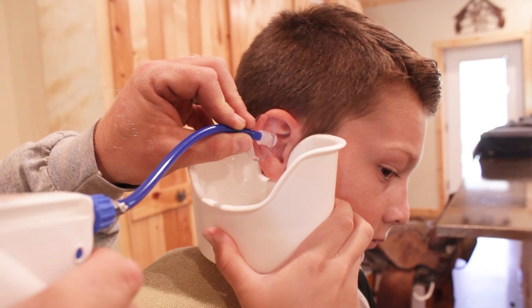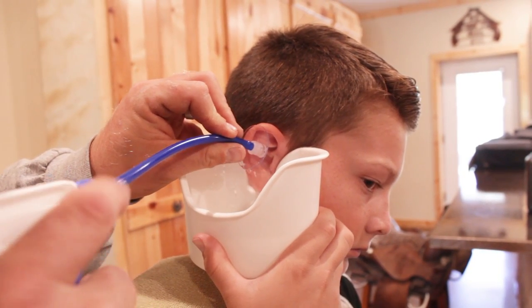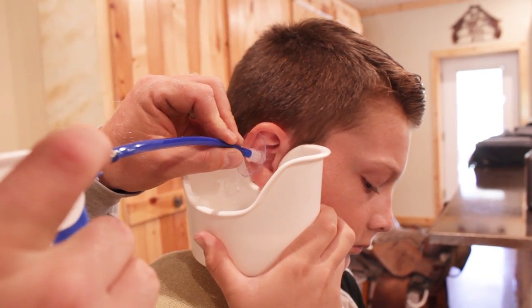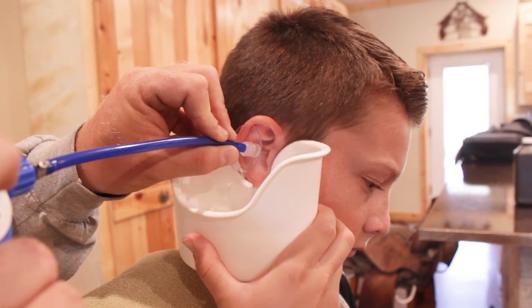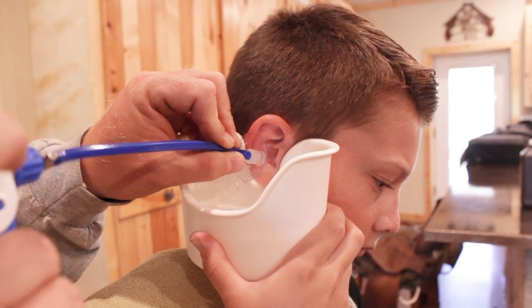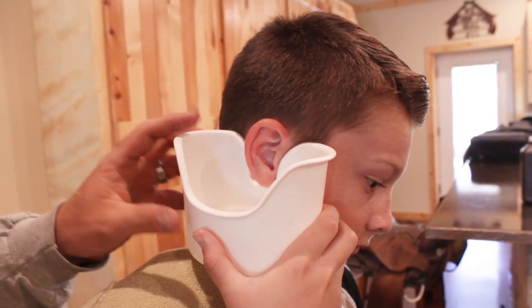Got your mouth closed? Close your jaw — sometimes that helps with any discomfort if they close their jaw. You move the tip and angle it however you need to in order to flush out any particles, anything that's already in there. His ears are pretty good.